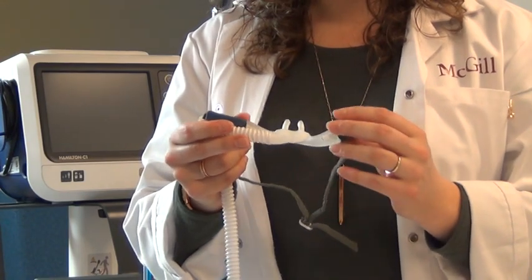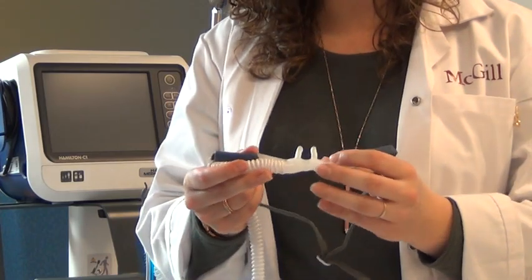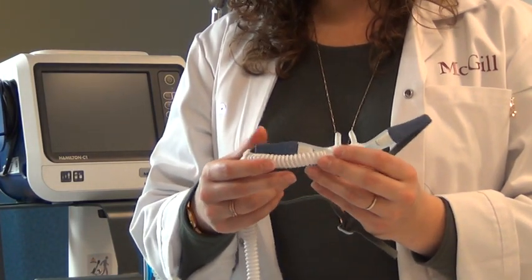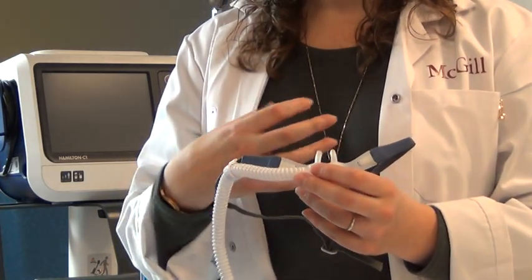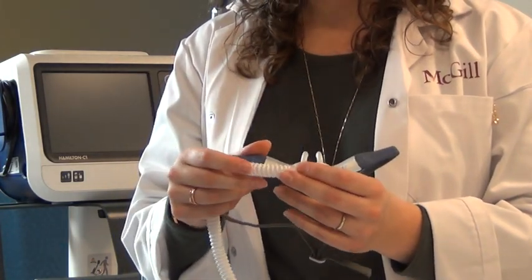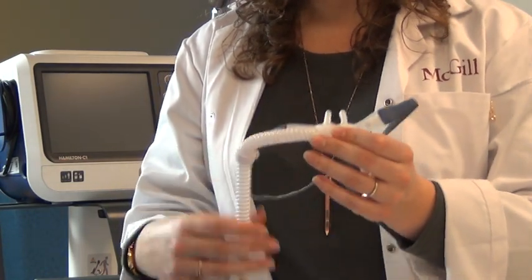So these are really for oxygen deprived patients that need high levels of oxygen. And having such a high flow of oxygen coming into their lungs actually provides them a certain amount of pressure to ensure that the airway is nice and open, similarly to a CPAP in a way.